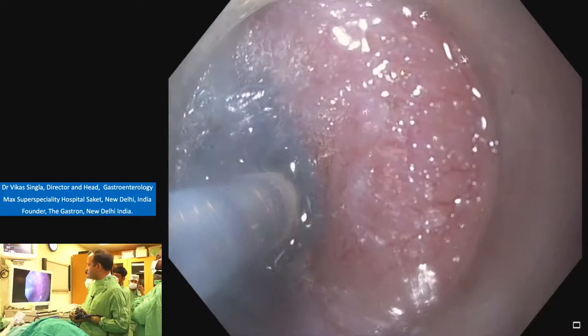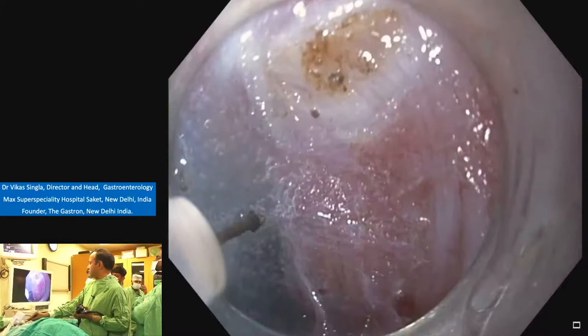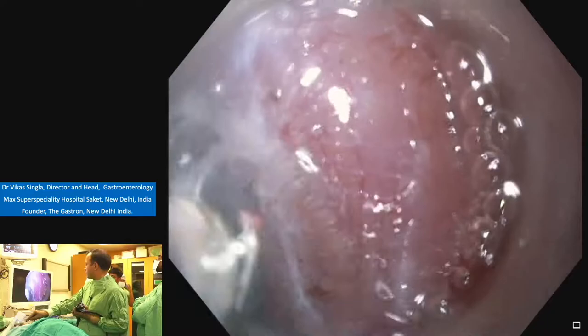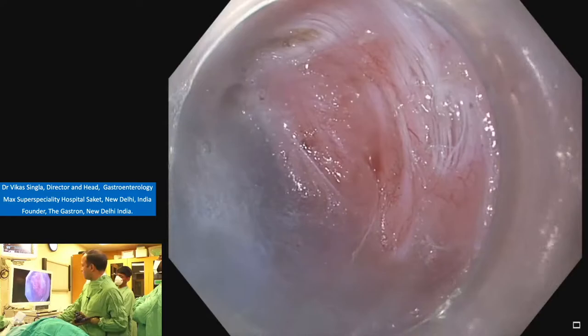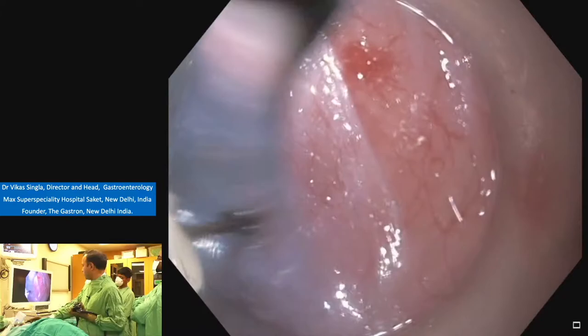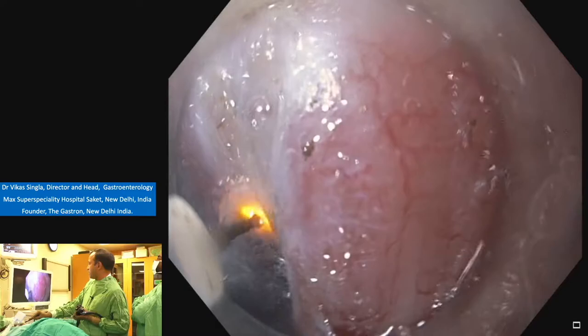So one should avoid the deep injury to the muscle or the mucosa while creating a tunnel. One should avoid the splitting of muscle layer at this stage. So you can see that always our knife is toward the right side, and right side is the muscle layer. And we have to go till the joining of mucosa and the muscle layer. Again, on one side we inject, start from one side, using a forced coagulation, we are making a hole, engage the fibers and go to the other side. So we have to repeat these steps.